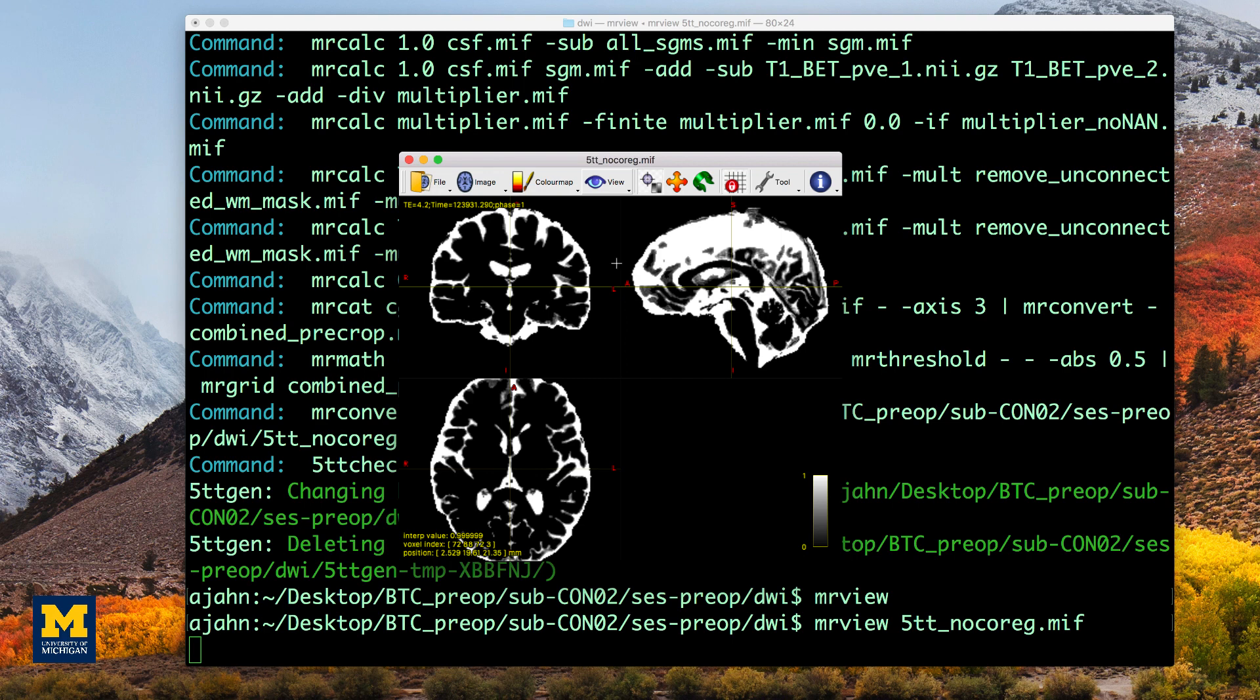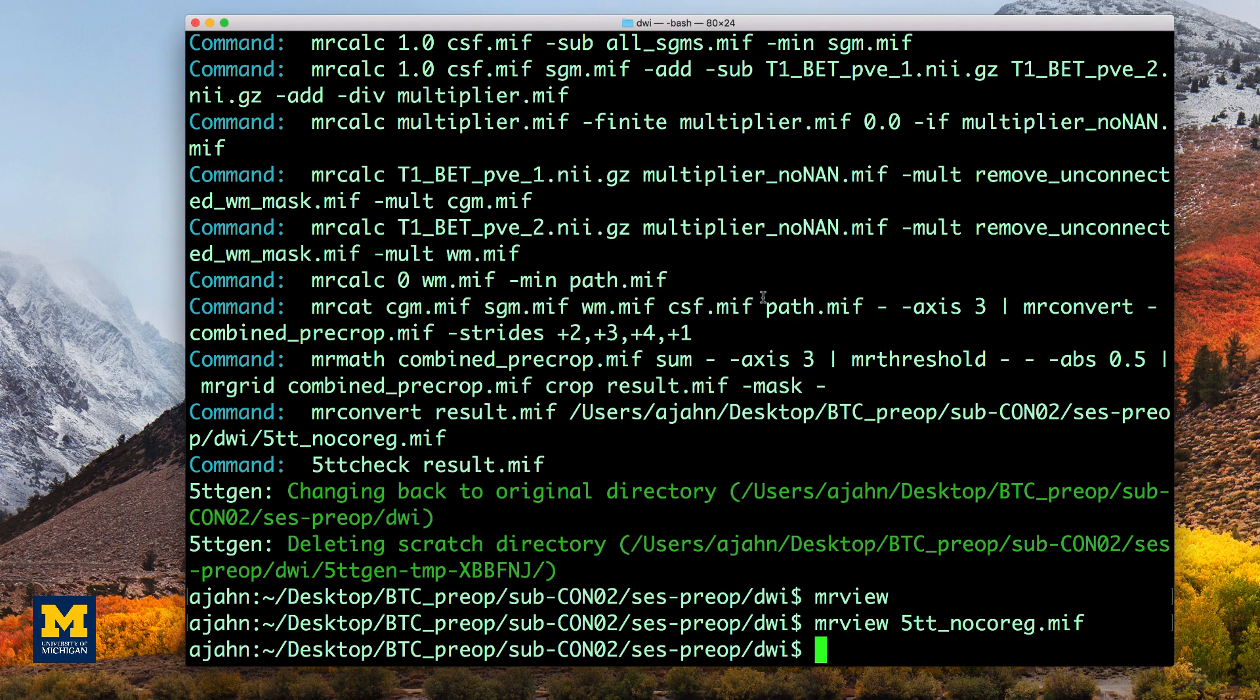Our next step is to co-register the anatomical and diffusion-weighted images. This ensures that the boundary of the gray matter is aligned with the diffusion-weighted image.